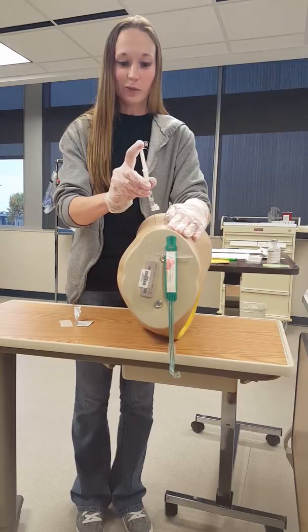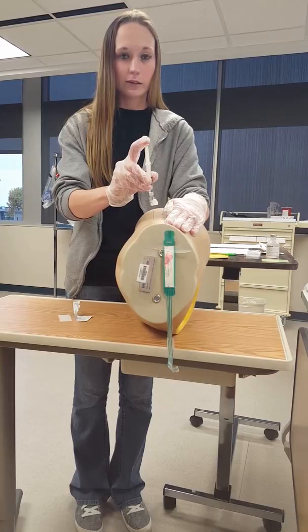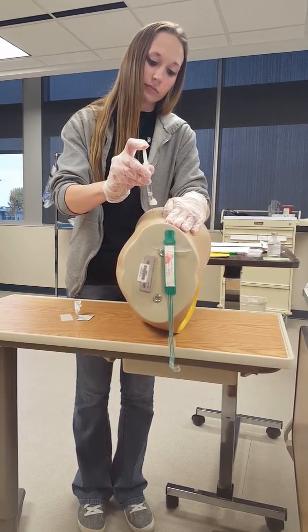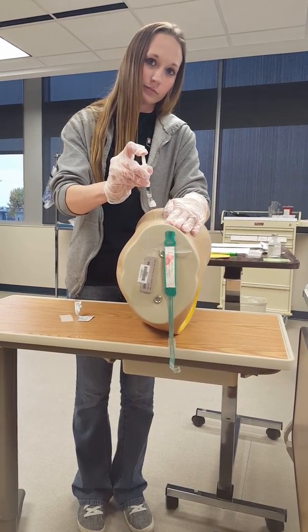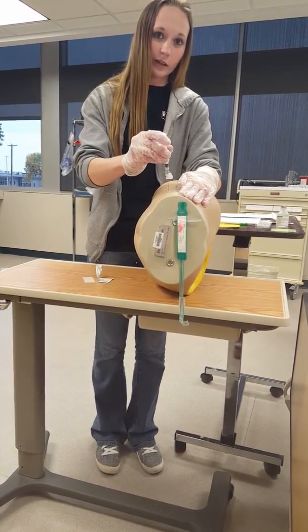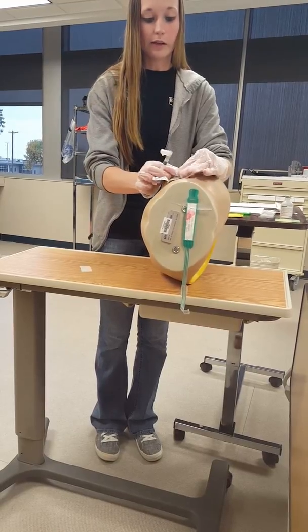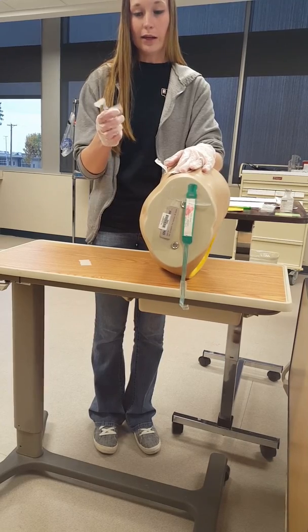And it won't let me go all the way down. And then I would do this over 10 seconds. And so I would count while I'm giving this. Okay, and then I would hold it there just for 10 seconds. And then I would pull out, and then I would put my gauze on here, and I would put some pressure on it just for a few minutes.